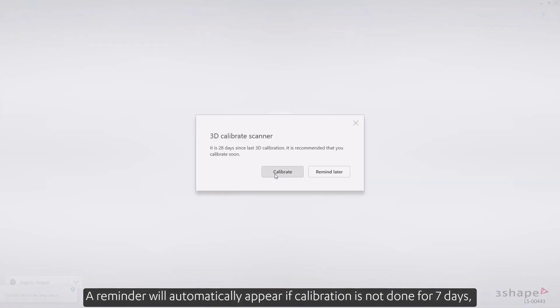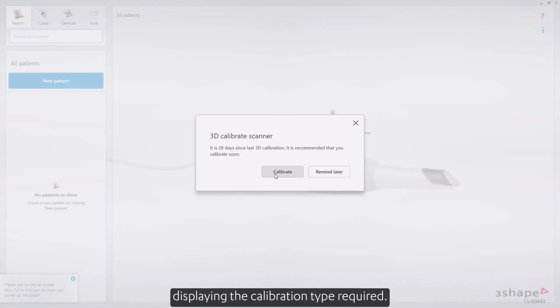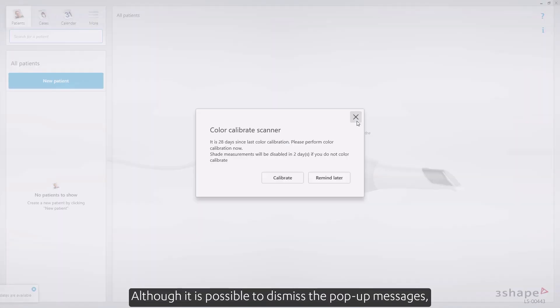A reminder will automatically appear if calibration is not done for seven days, displaying the calibration type required. There are two ways of initiating calibration: from the pop-up message or via the settings page. Although it is possible to dismiss the pop-up messages, it's not recommended to ignore these warnings.